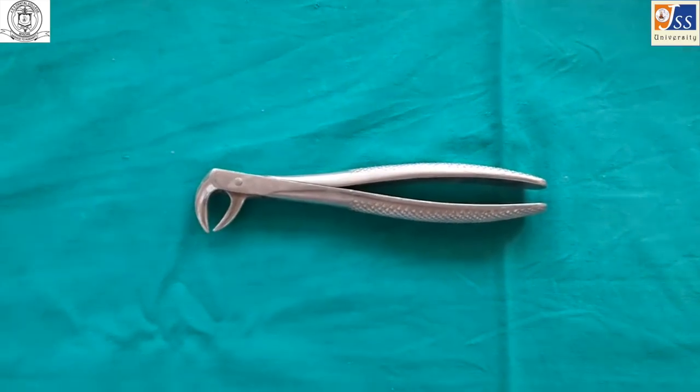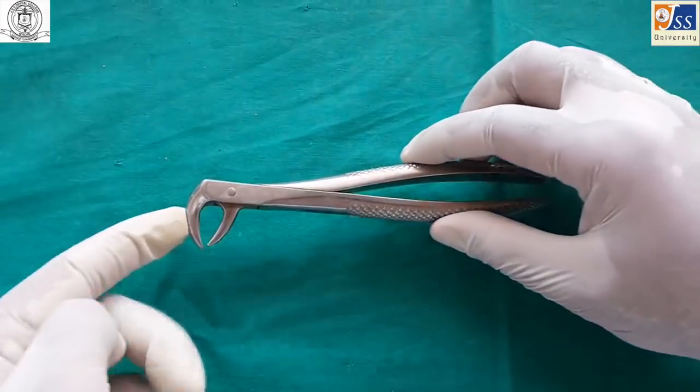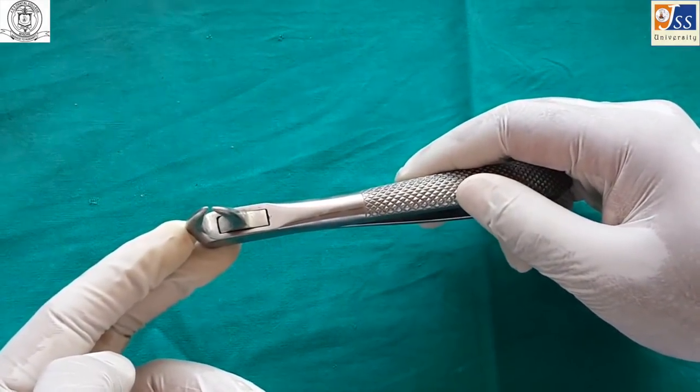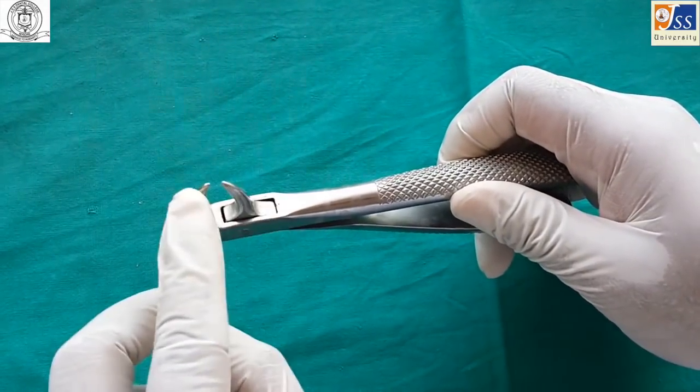The mandibular cow horn forceps is also a single instrument for both sides, used in cases of grossly decayed teeth.